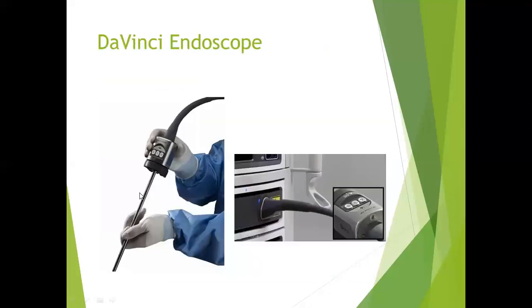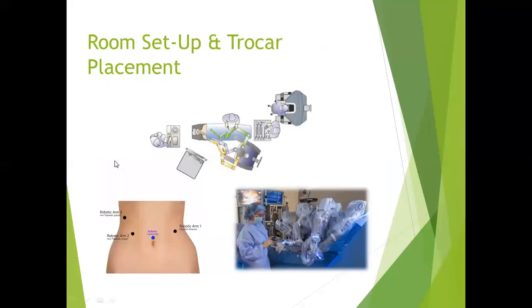This is a Da Vinci endoscope. I just put this in here because I want to make sure you see what the endoscope is like. And this is an XI, I believe. It's a little bit different than ours, but they're pretty bulky. I'm just showing you how it's plugged in.